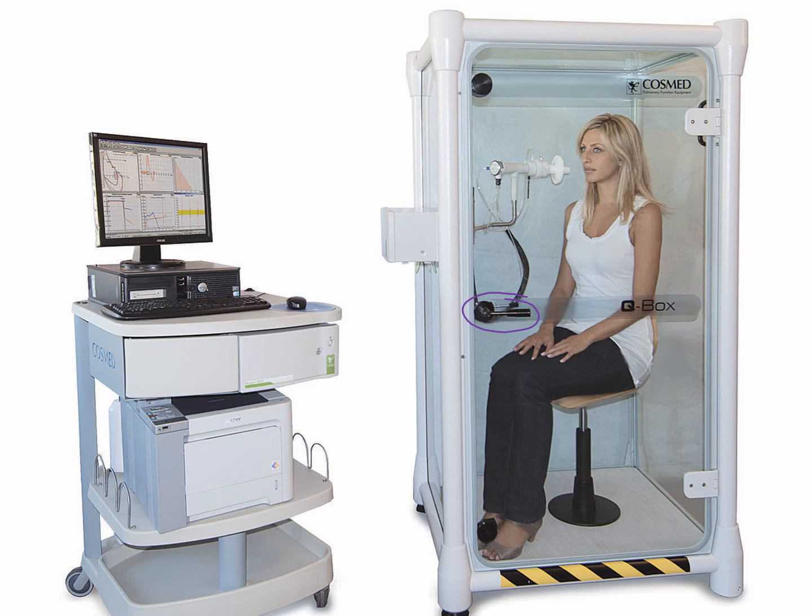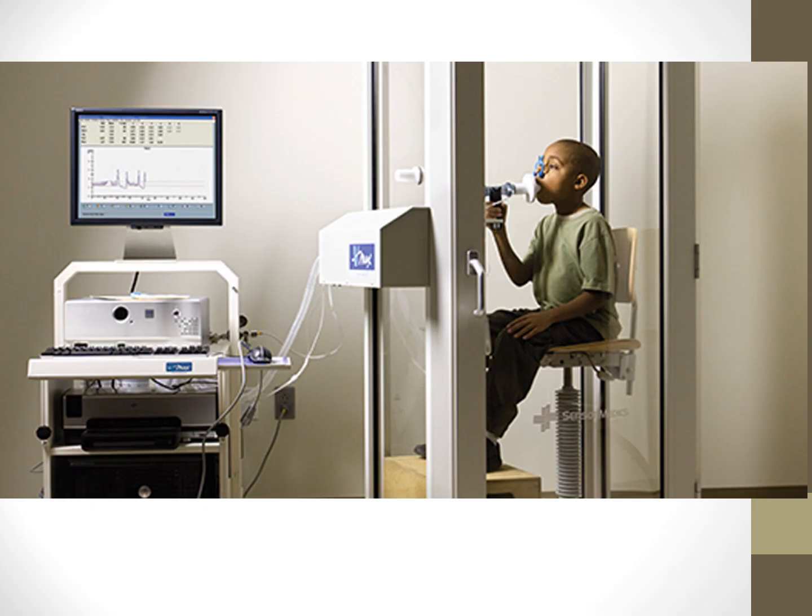And so they're just in the box. It's not too big. It's like an old phone booth, if you ever remember one of those things. And we even do this with little children. Little kids can go into these things. As young as like 4 years old can do some types of pulmonary function testing if they're able to follow the directions and the procedure to do it.